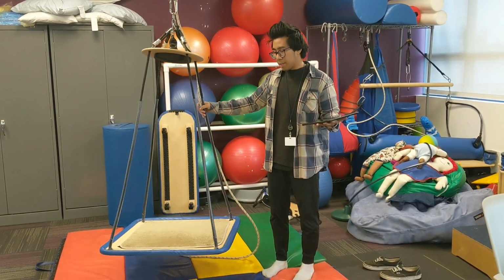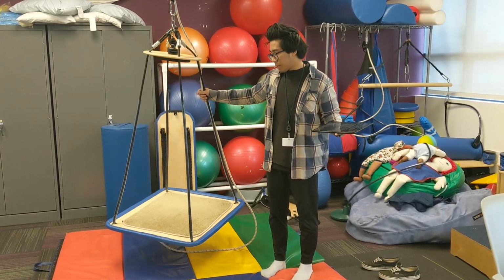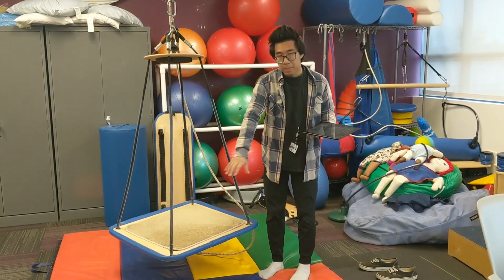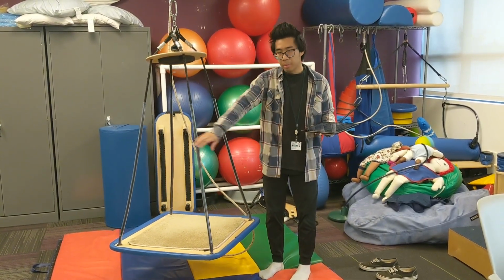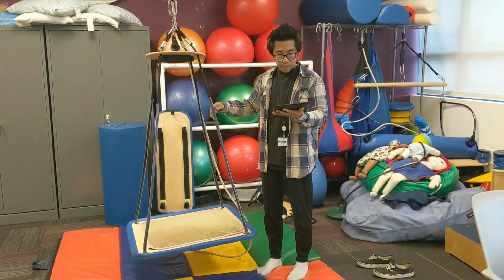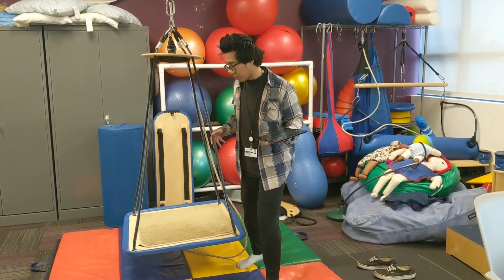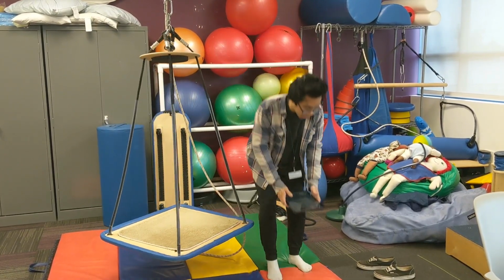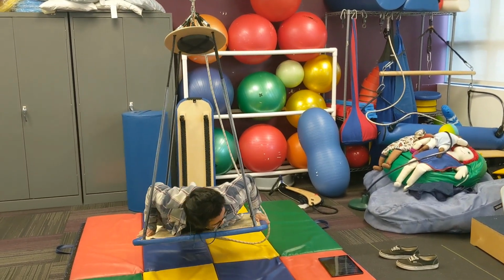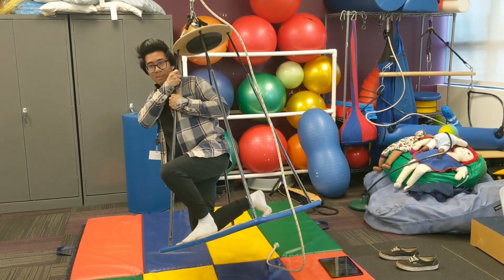As the swing rocks back and forth, perhaps in a treatment session, you would have the child on their belly, and then they could pick up various objects and categorize them into buckets or different colors. It also helps with your dynamic balance. So the child may be sitting, kneeling, or even standing. Let me just show you. The child can be prone, kneeling, or sometimes they can even be standing.